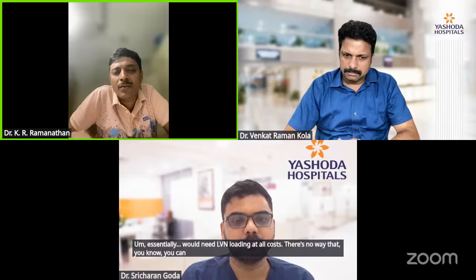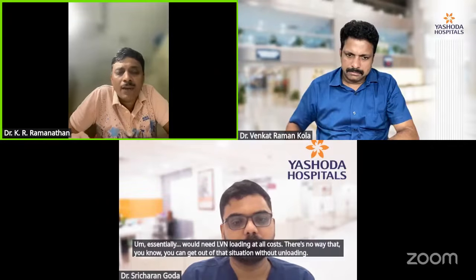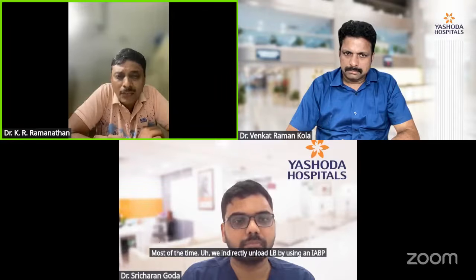There's no way that you can get out of that situation without unloading. However, if you look at LV unloading strategies as a whole, most of the time we indirectly unload the LV by using an IABP along with ECMO.